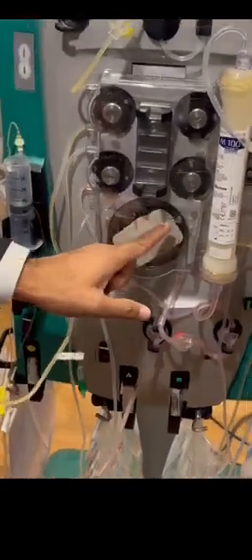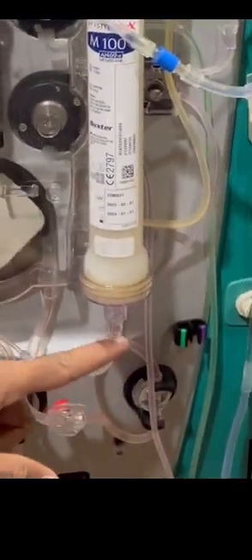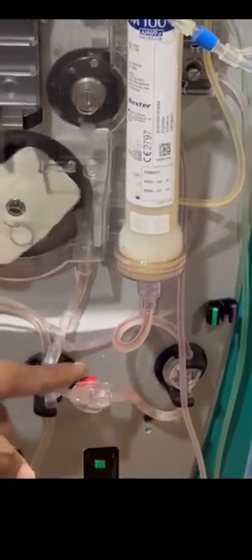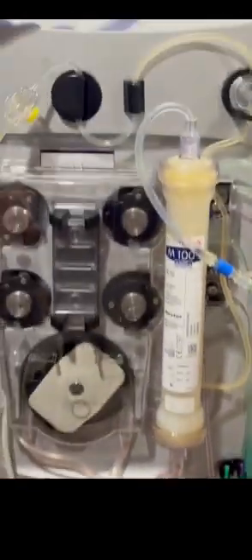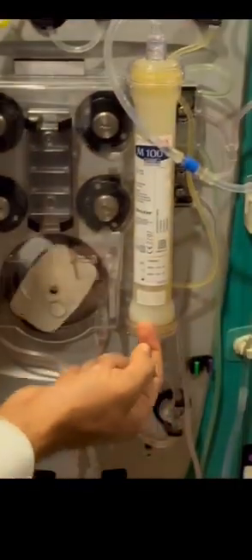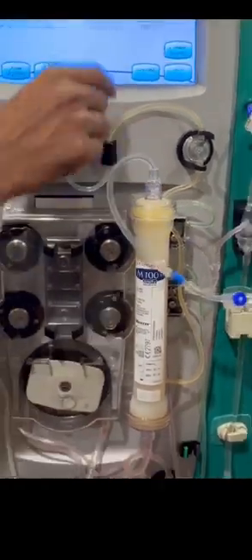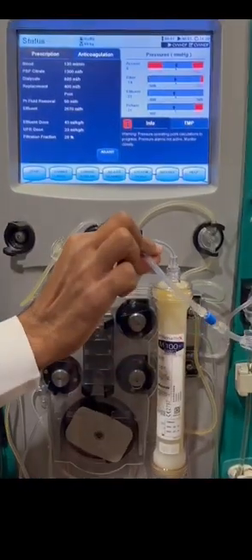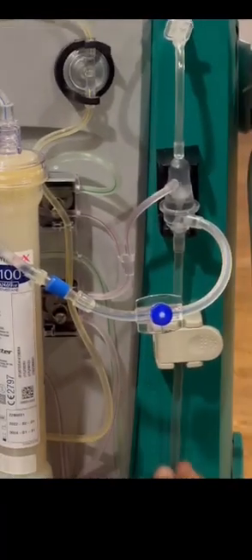Then it comes to the blood pump. From the blood pump, this goes to the filter. Before the filter and after the blood pump, there is a pressure pod that will measure the filter pressure. If there is some clot in the filter, this will increase. Then blood is in the blood inlet. The flow is like this. This is the blood outlet, blue in color. Then this goes to the deaeration chamber, then the air detector, then the line clamp, then to the patient. This is the blood circuit.